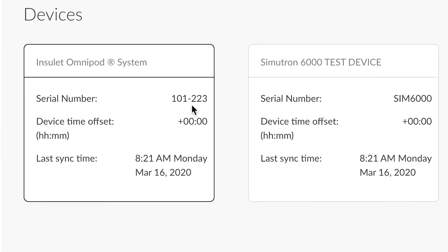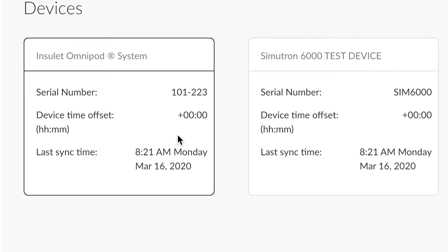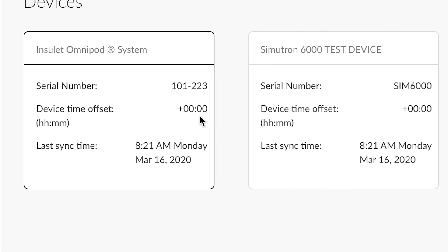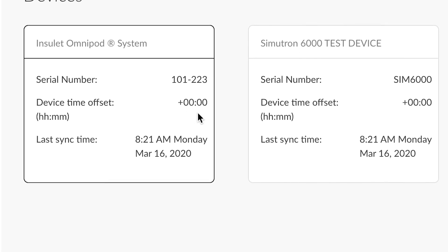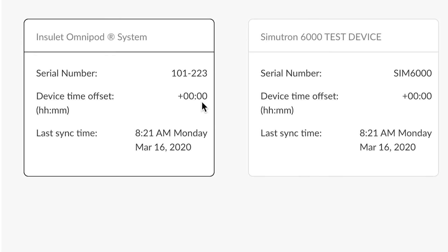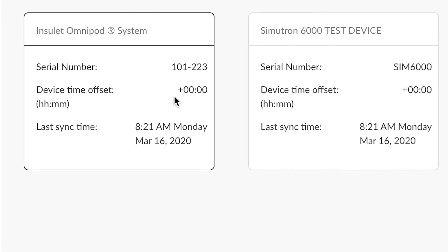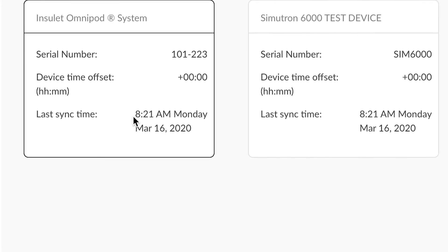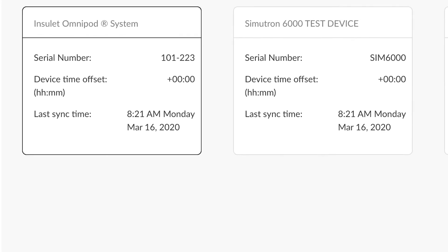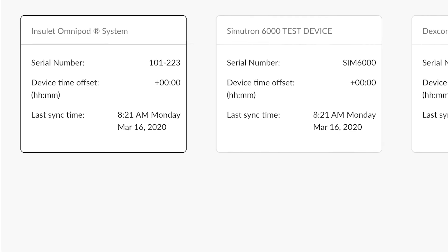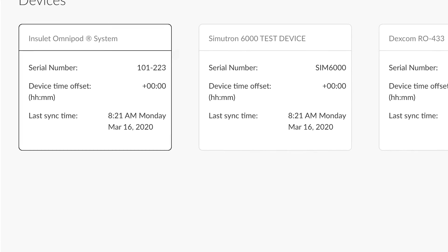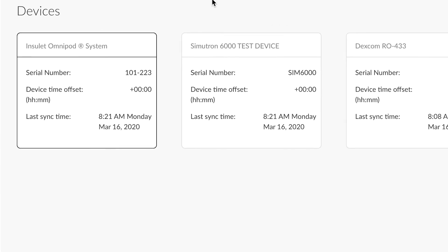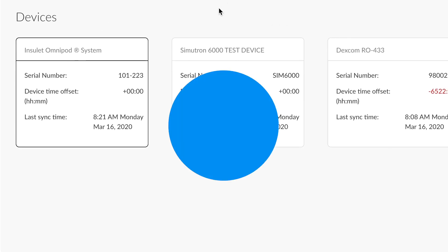It also gives you data about the serial number of the device, if the time is accurate or not at the time of the upload, and even the last sync time. It's a great way to see if a patient has actually successfully uploaded their device recently.